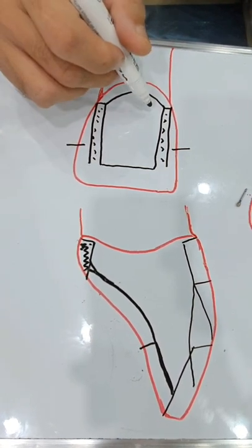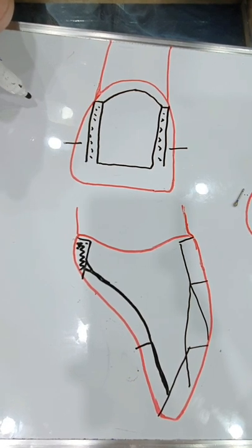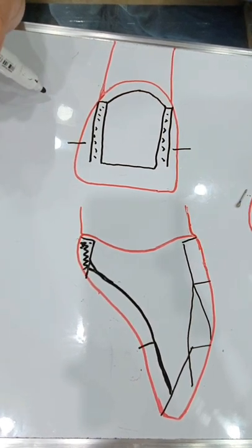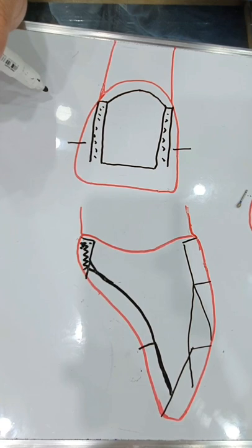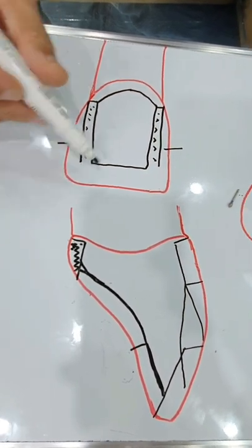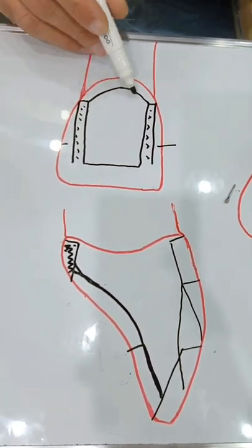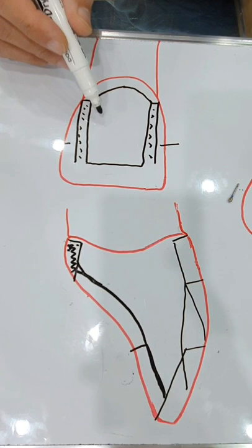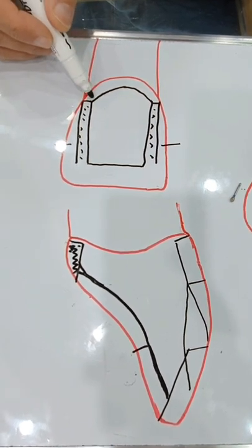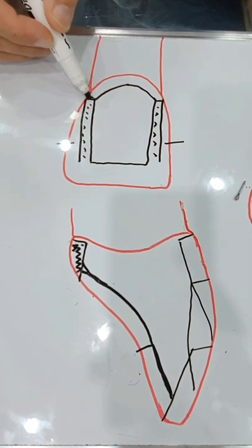Or a crown is done, then the adjacent teeth develop class 2 restorations, interproximal cavities. Once I remove them or I start cleaning them up, or on the radiograph I also see that the adjacent tooth structure has been totally cut as they were prepping the tooth that has a crown on. Following this technique, you do the facial margin, you do the lingual margin, and then you just connect the facial to the lingual at the margin depth here at the gingival level.